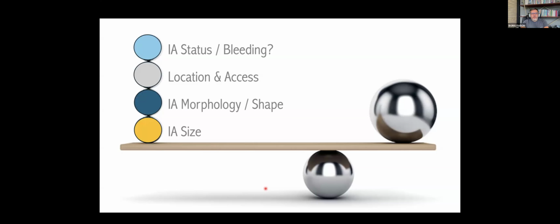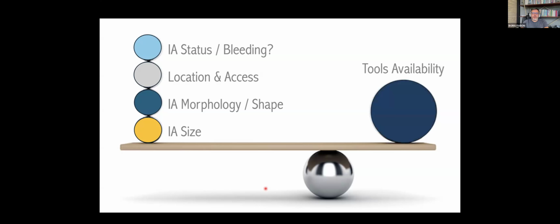Obviously, the aneurysm size is critical. With most technologies, you have a restriction or limitation if you are dealing with an aneurysm at the borderline zone, between 9 to 10 millimeters. With this new technology, you have the possibility to treat conditions up to 20 millimeters.